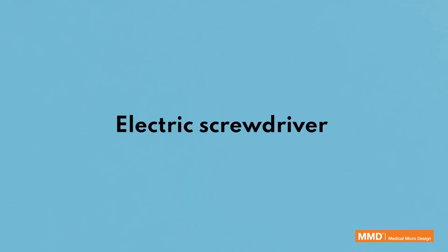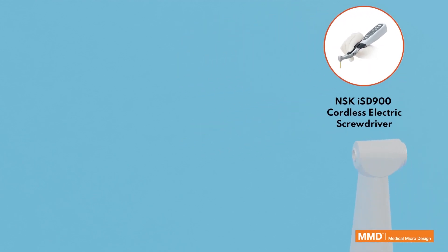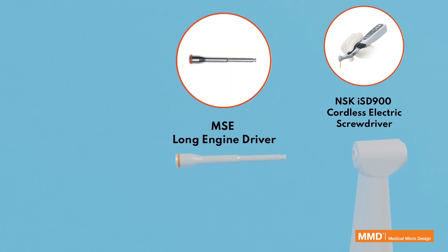Electric screwdriver used: NSK ISD 900 Cordless Electric Screwdriver. The appropriate attachment is the MSE Long Engine Driver.